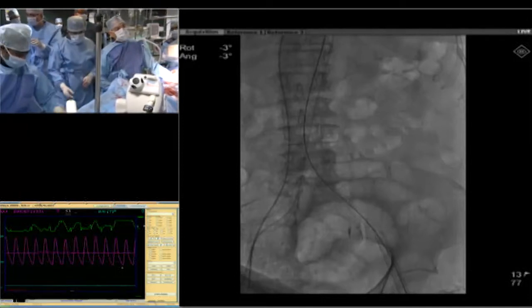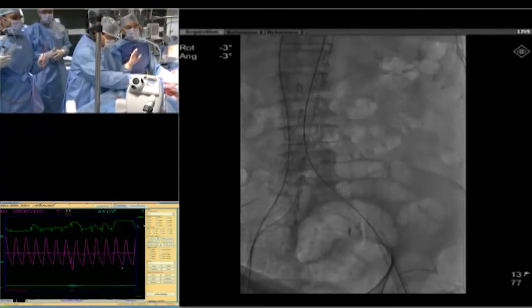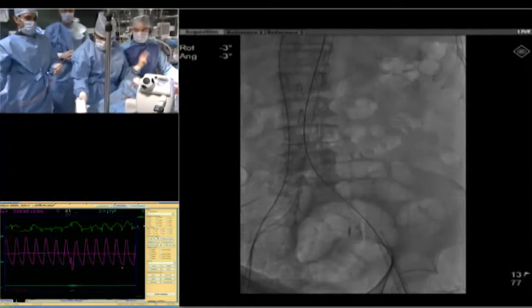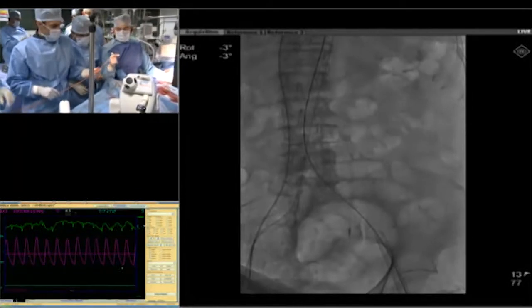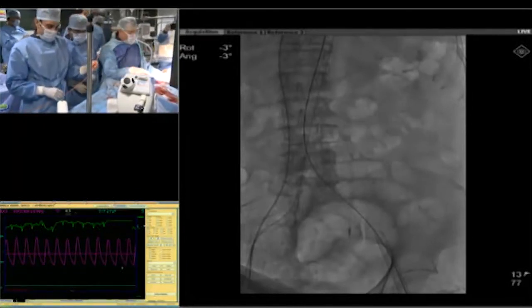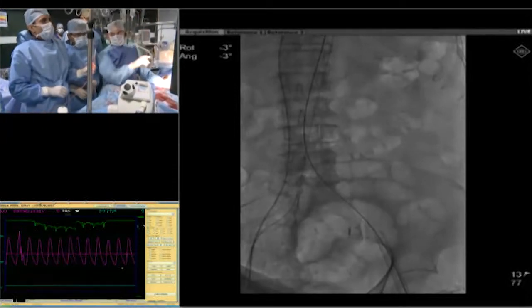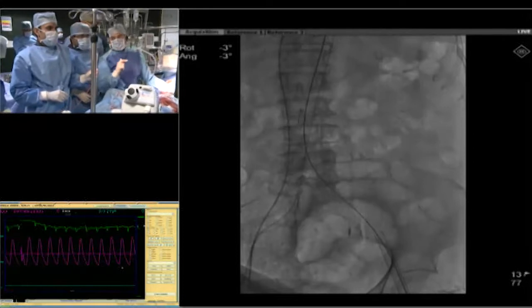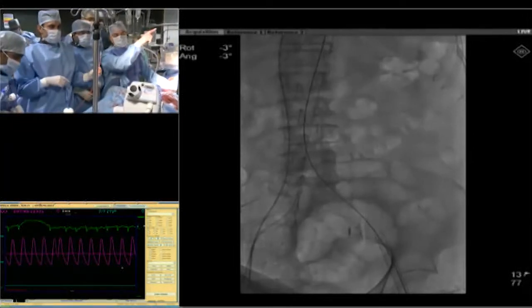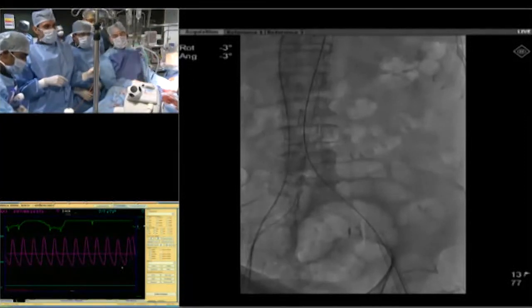So now we again have to confirm two things. Raju and company, please listen to me. I want full concentration, no talking in between. The steps are following. The pigtail has to be positioned. This valve would be advanced now through the sheath. It'll go right into the ascending aorta. When we go into the ventricle, our coplanar view would be in position. So we have to go to LAO 15 that was showing all the things in the same plane.